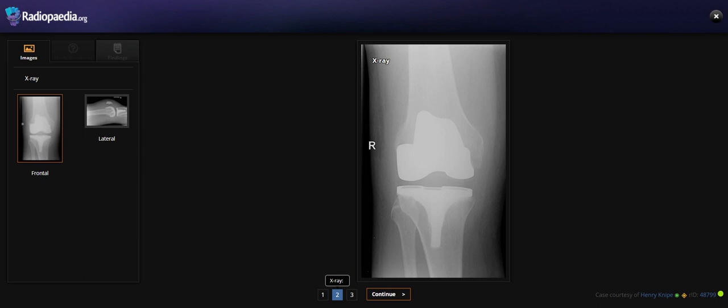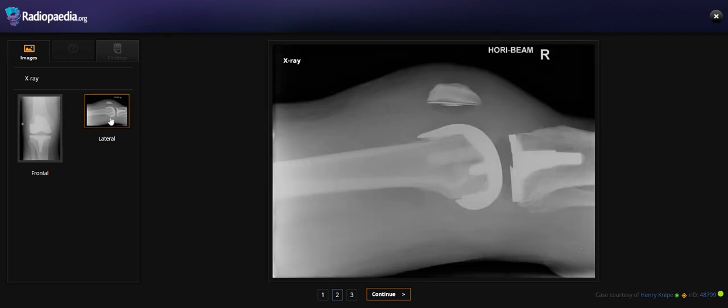So this is a frontal radiograph. What we can see here is knee replacement material. Otherwise, we cannot find any abnormality in the frontal view.